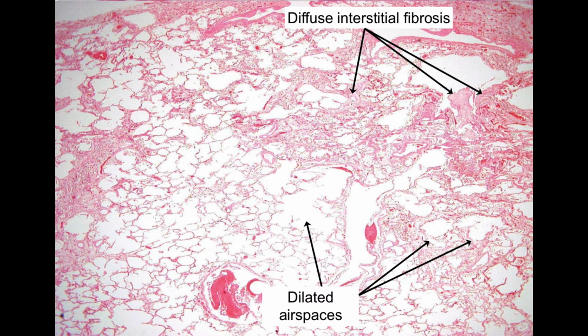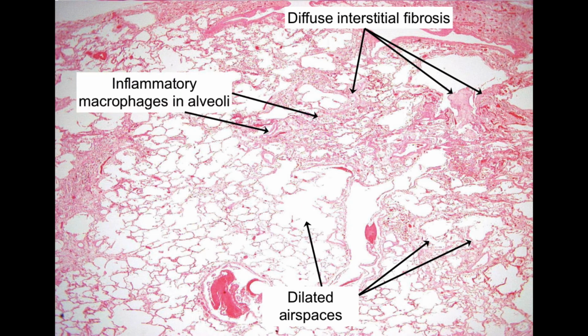Several of the adjoining air spaces show severe dilation and destruction from an inflammatory process similar to that seen in emphysema. There is also evidence of macrophage accumulation within the alveoli. The pleura is fibrotic and much thickened, and some of the vessels in the pleura are significantly congested.